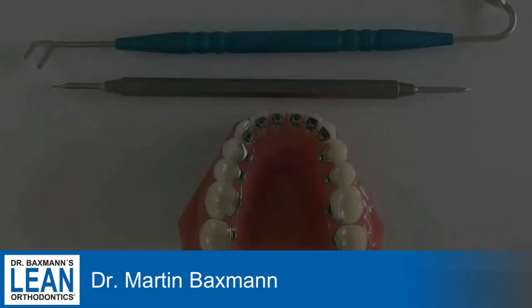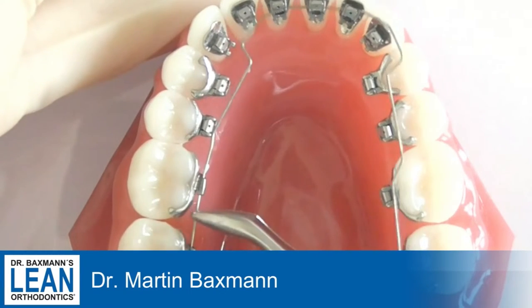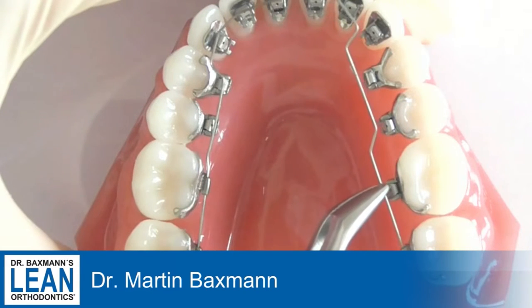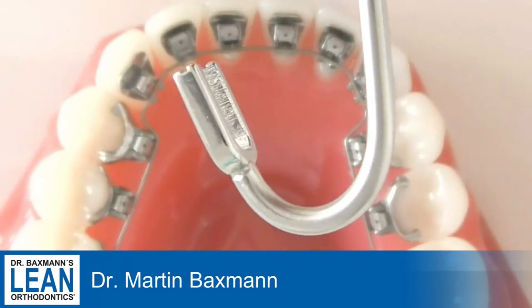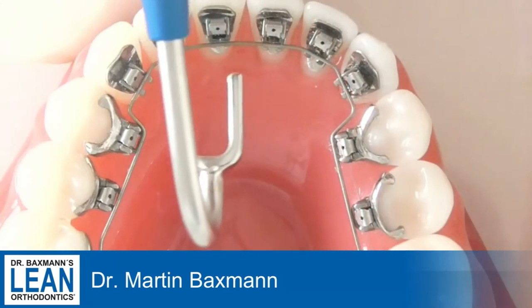When you're doing your arch wire changes in lingual appliances, it can be such a hassle to tie in the wires and to hold them in place and put them really fully in the slot. And that's where my special instrument comes into play.